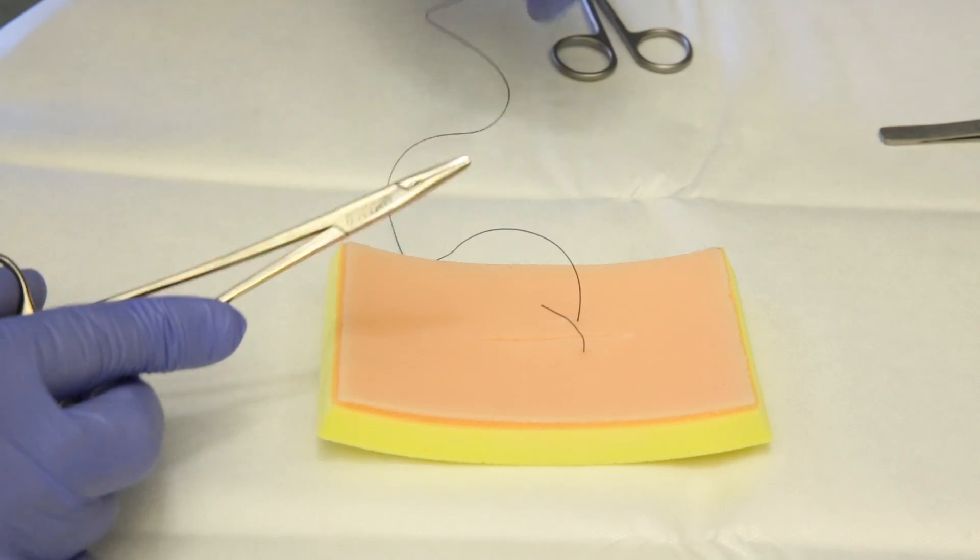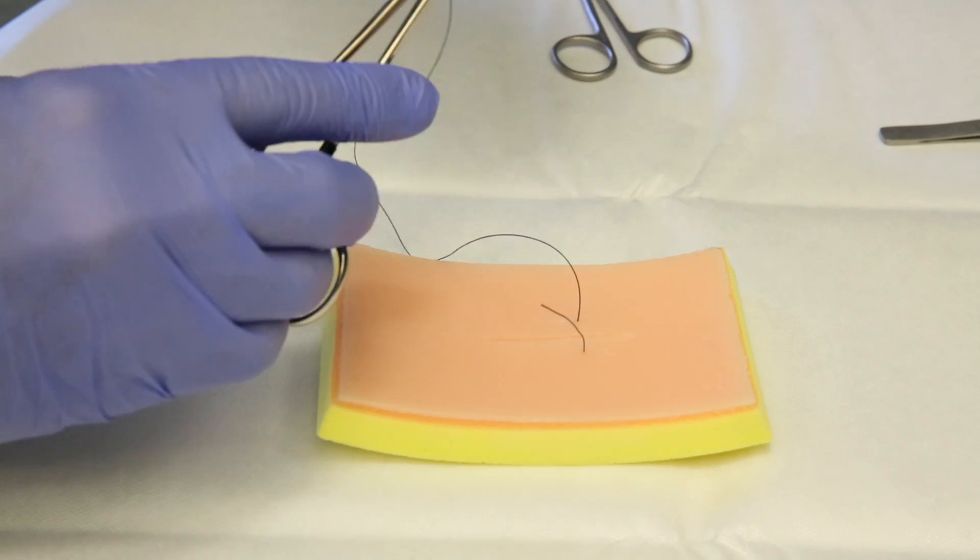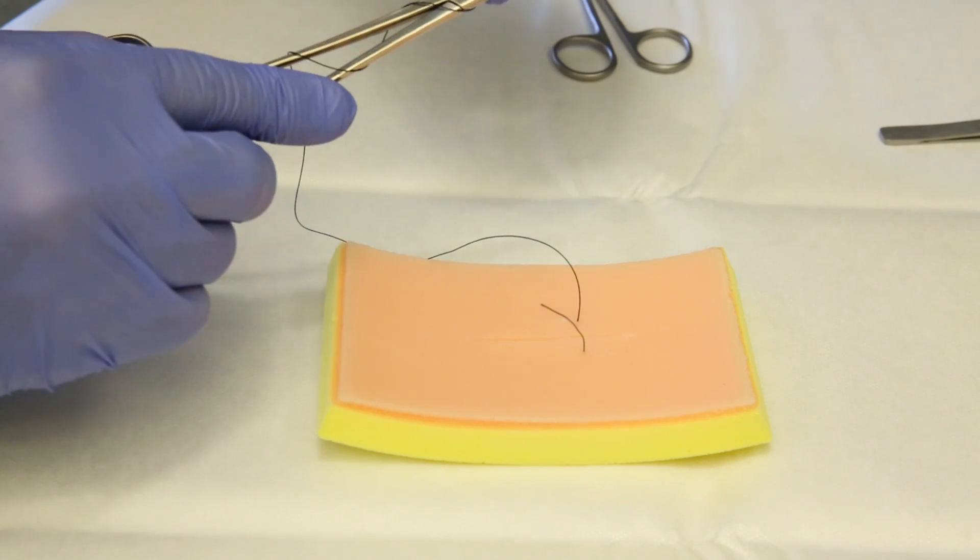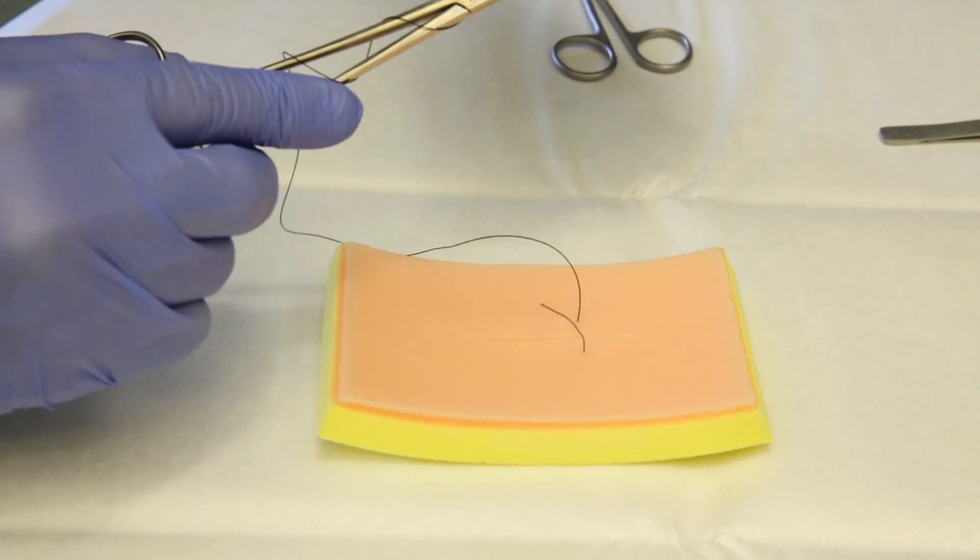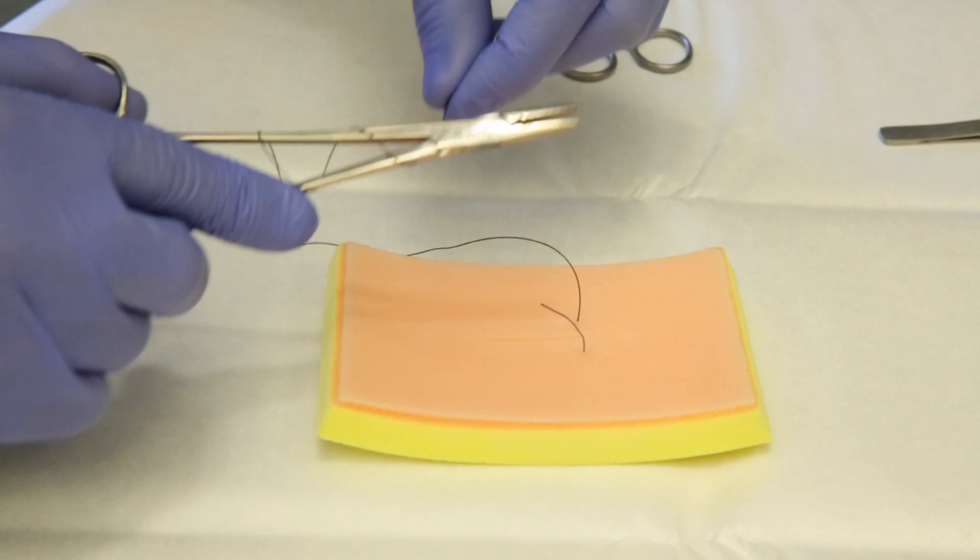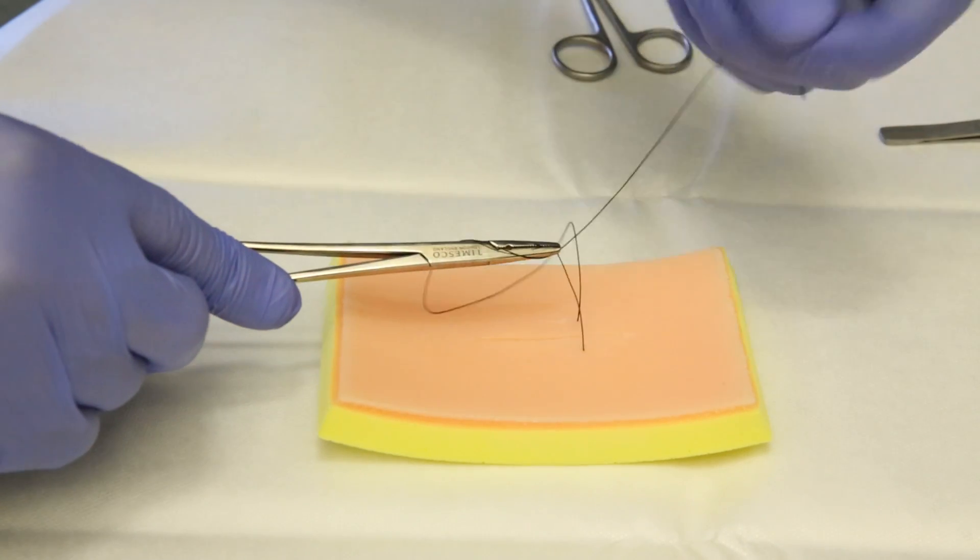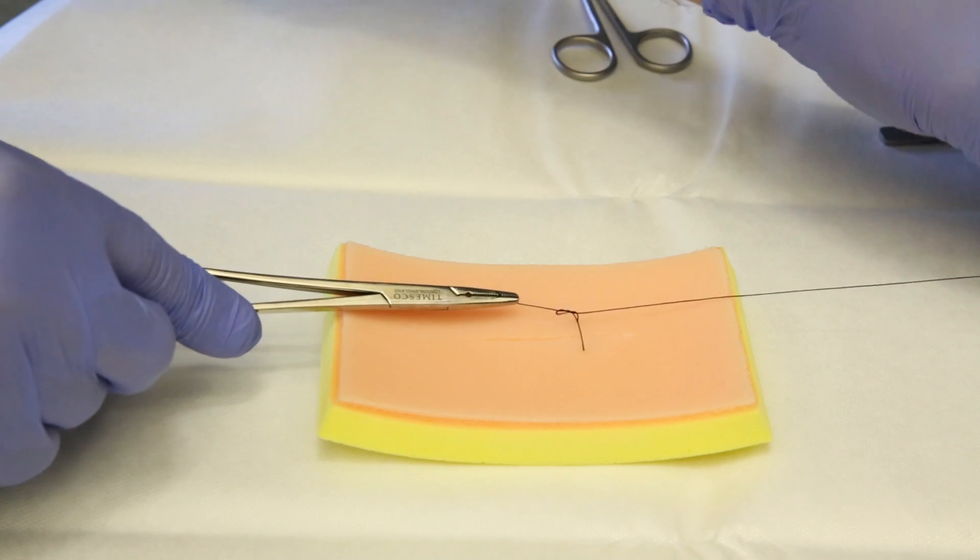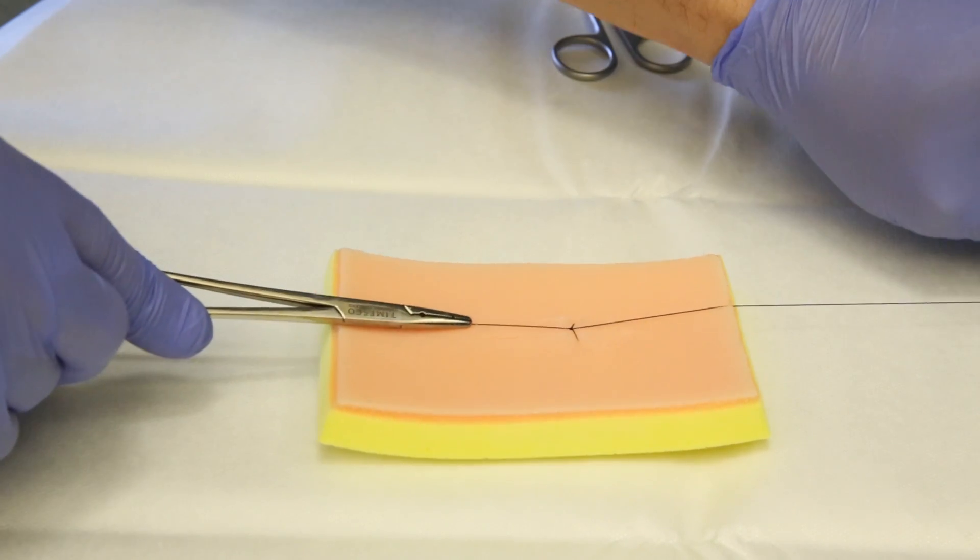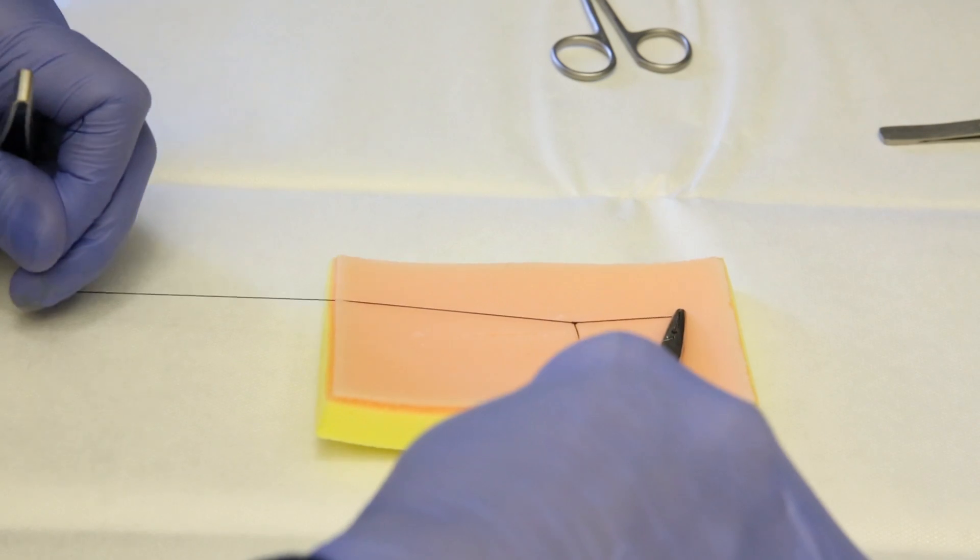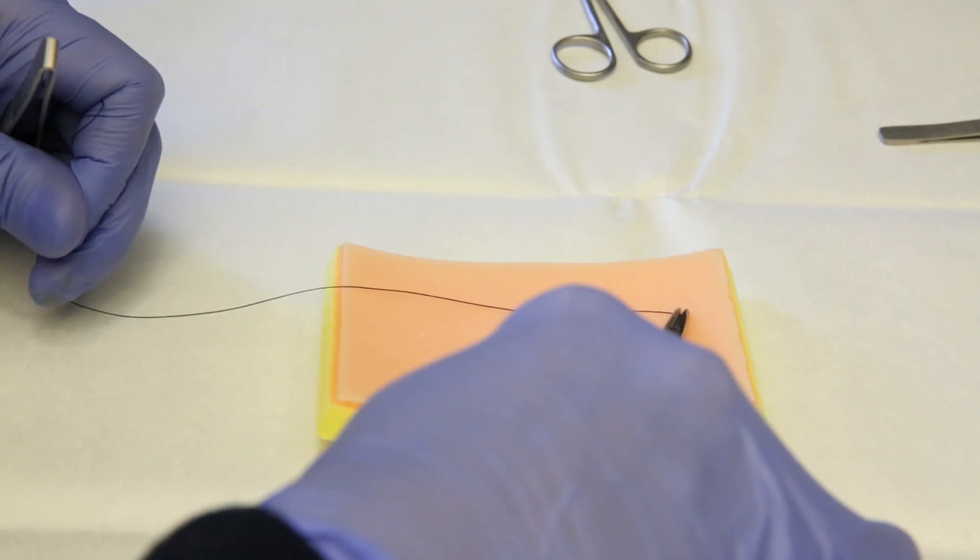Making the surgical instrument knot, so the needle holder, we turn the thread two times around it. You can start with clockwise or anti-clockwise. And then taking the end of the thread and pulling the thread out of the instrument. We stay parallel to the wound, as you see here.